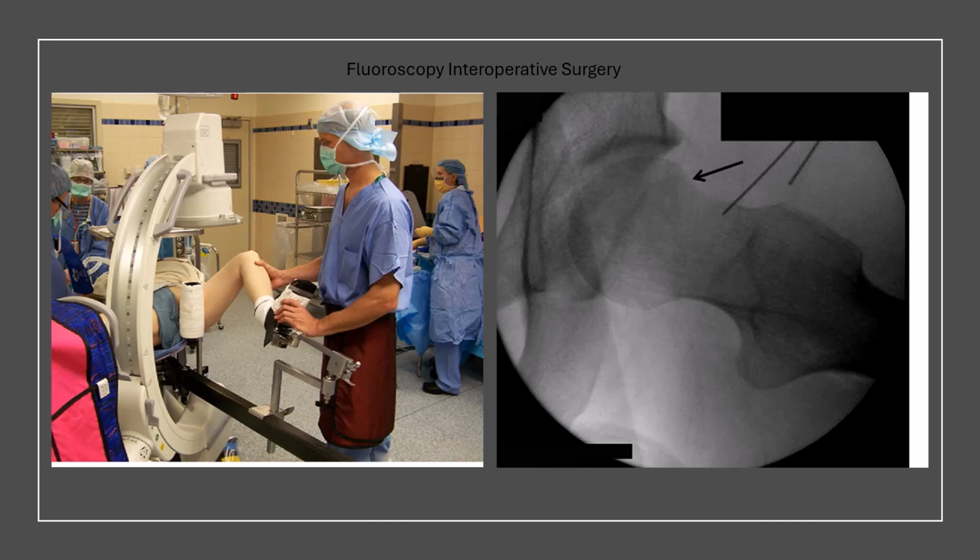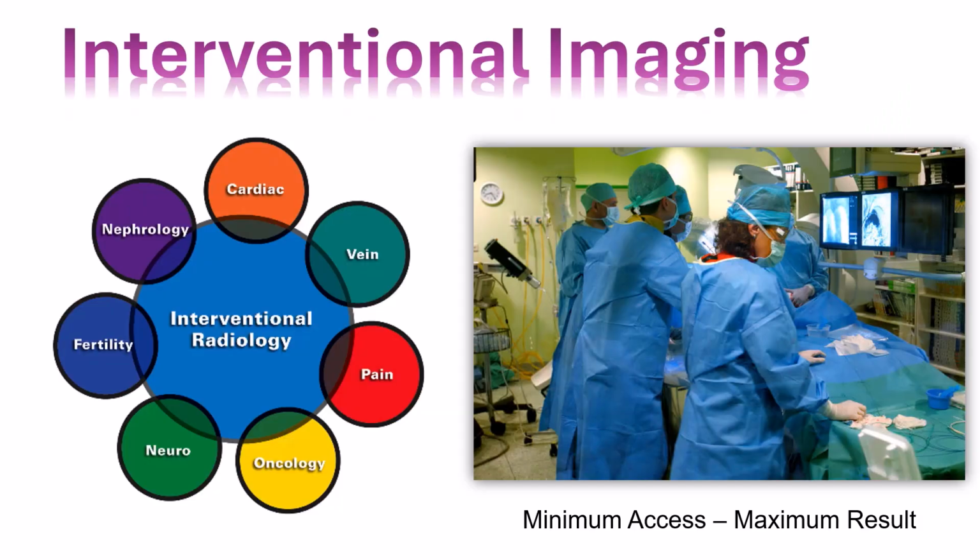Fluoroscopy is utilized in a number of intraoperative procedures, from orthopedics to nephrology. It is also utilized in interventional imaging in radiology. Fluoroscopy is used extensively in interventional imaging, and interventional imaging is a specialty for radiologists today. Let's take a look at interventional imaging and some of the uses we have for fluoroscopy.